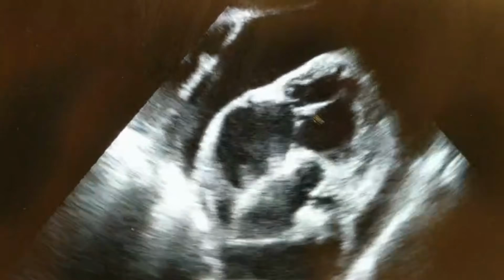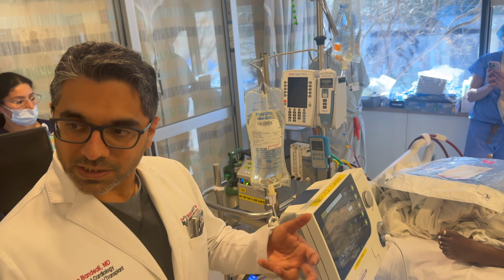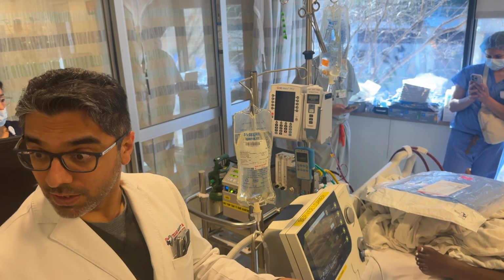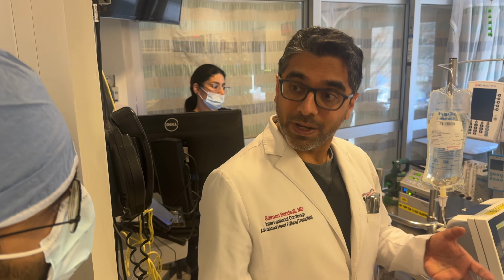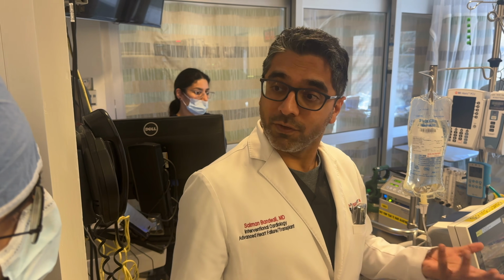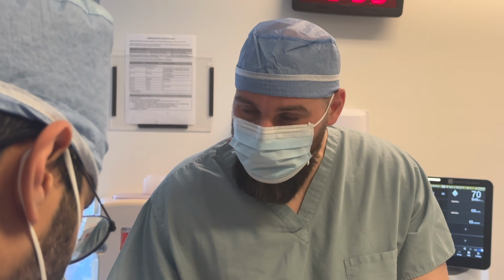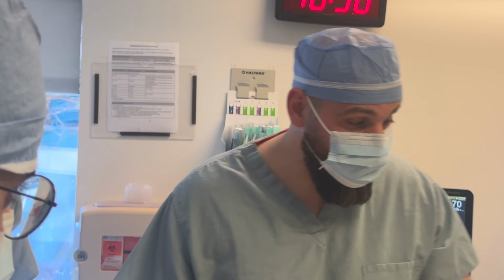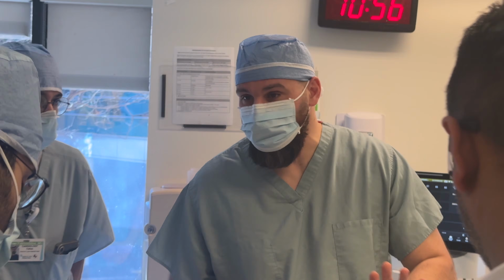For ECMO to flow, you have to have adequate flow in the venous system, especially the RV or the IVC or SVC where it's draining from. If you don't have it because it's compressing it, then it will basically collapse it and you will not flow. So this is classic for any hypovolemia, anyone who has increased intrathoracic pressures or increased intrapericardial pressures. You're going to have the same thing, yes.